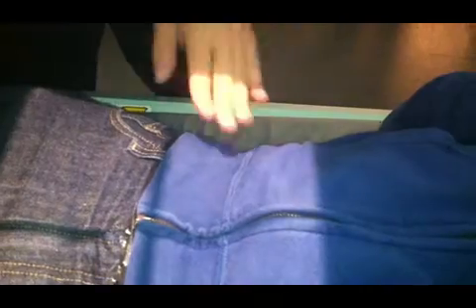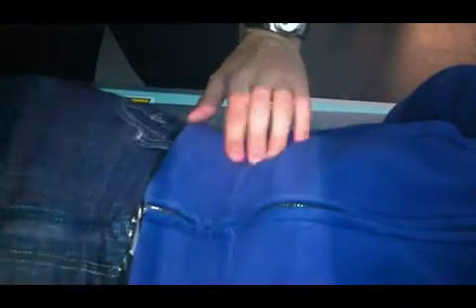The only thing you need to do is center side to side now. That's when you put both fingers on the ASIS on both sides. And then you just measure that off from there. If it looks like you got equal light field, either going here to here or here to here, equal on both sides, then you know he's centered down the middle. So we have it centered side to side and top to bottom. Fine. Okay, so it's all set there.